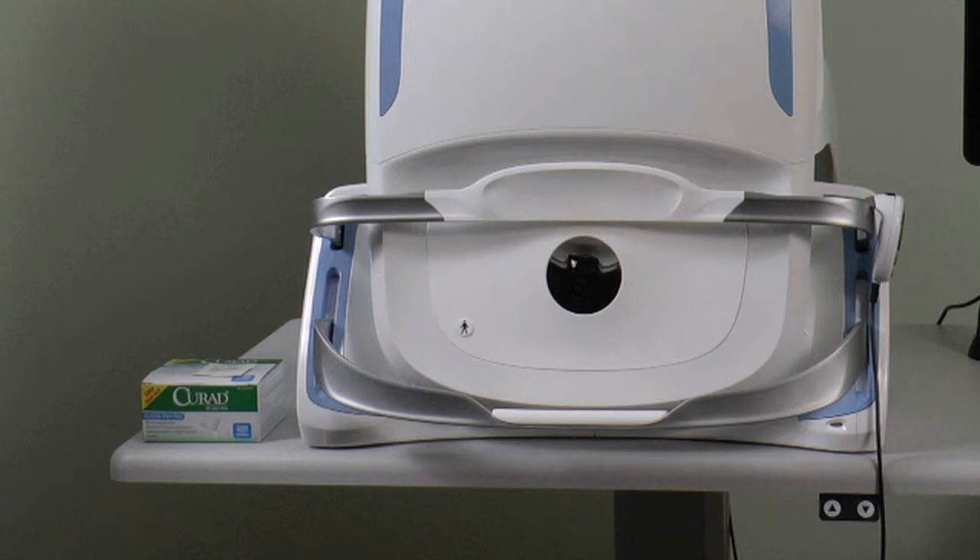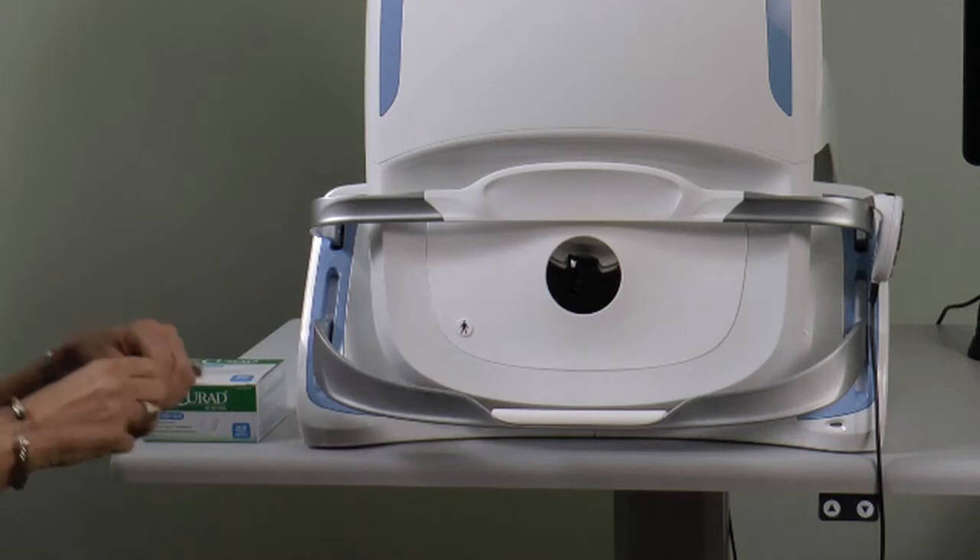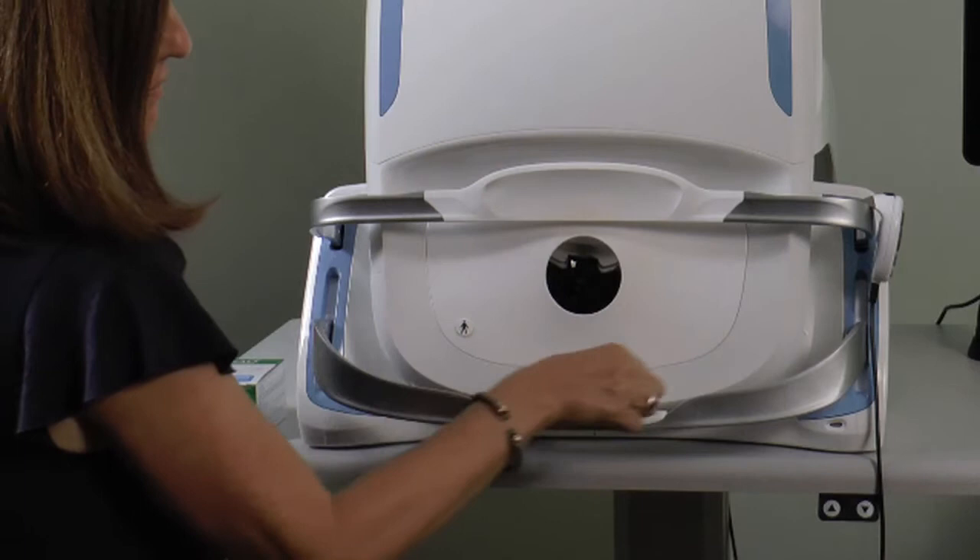The device must be cleaned before each patient using an individually sealed 70% isopropyl alcohol wipe. Thoroughly wipe down areas that the patient will come into direct contact with, allowing sufficient time to dry before imaging.